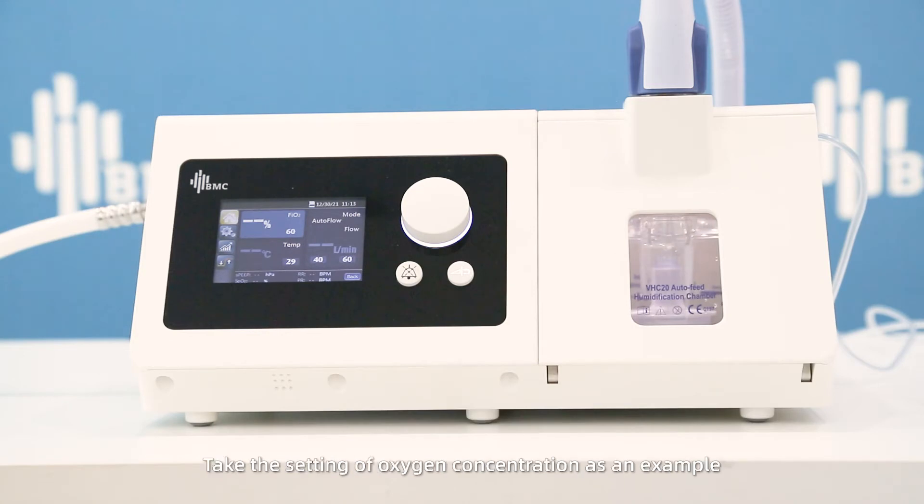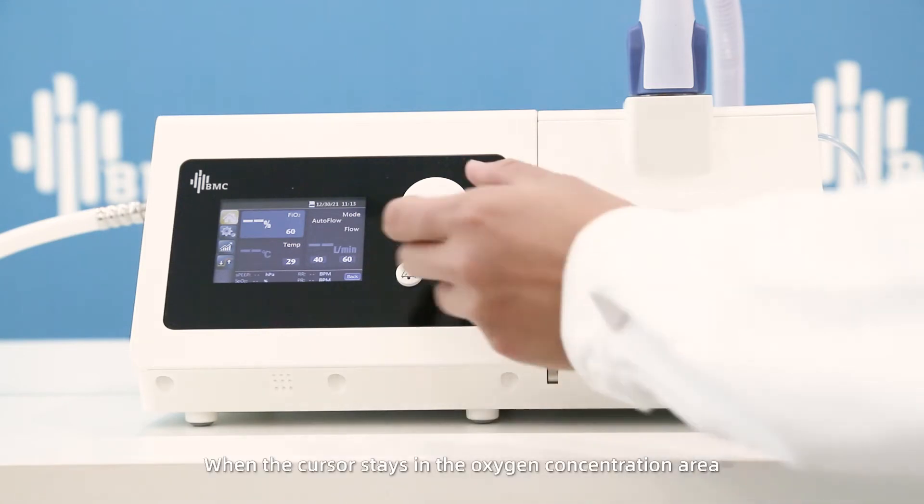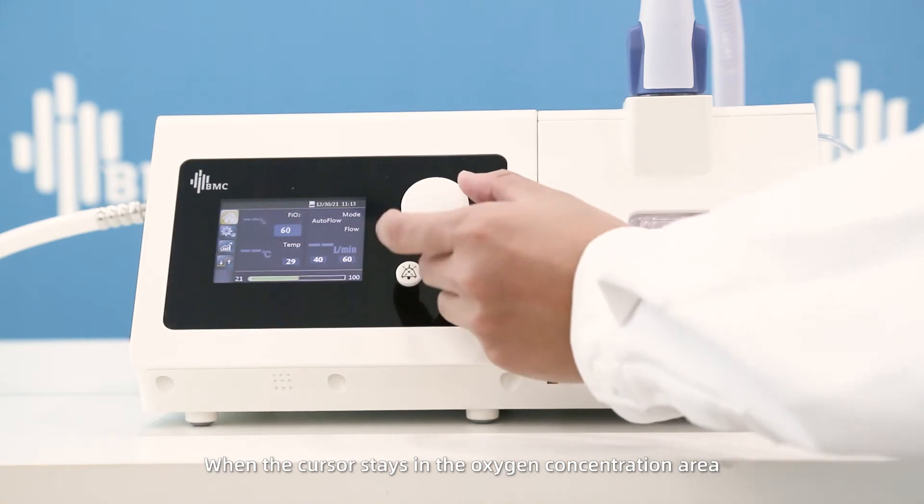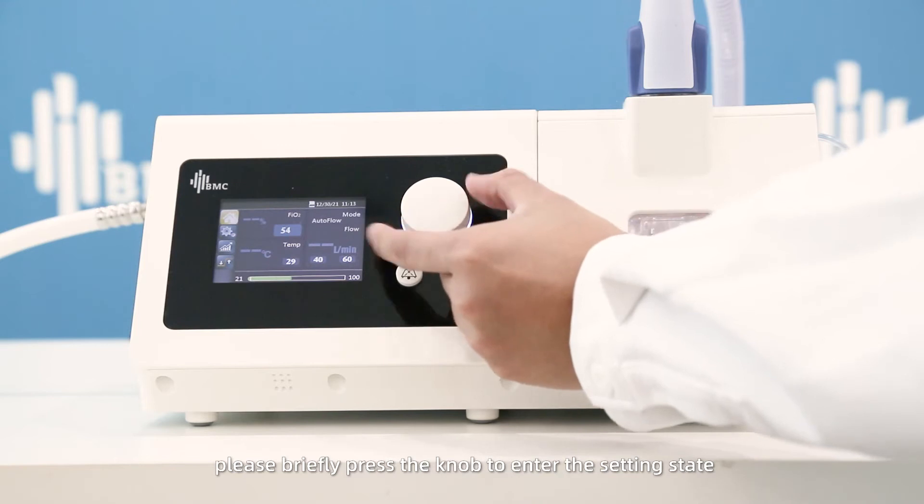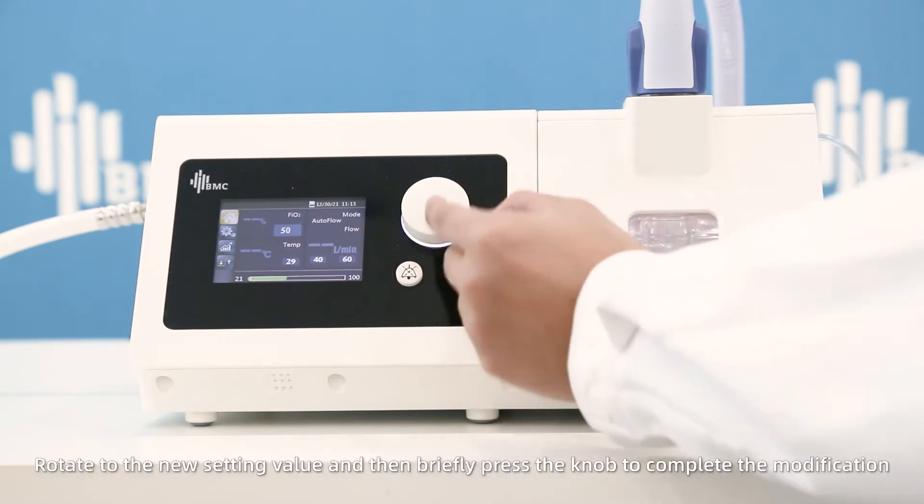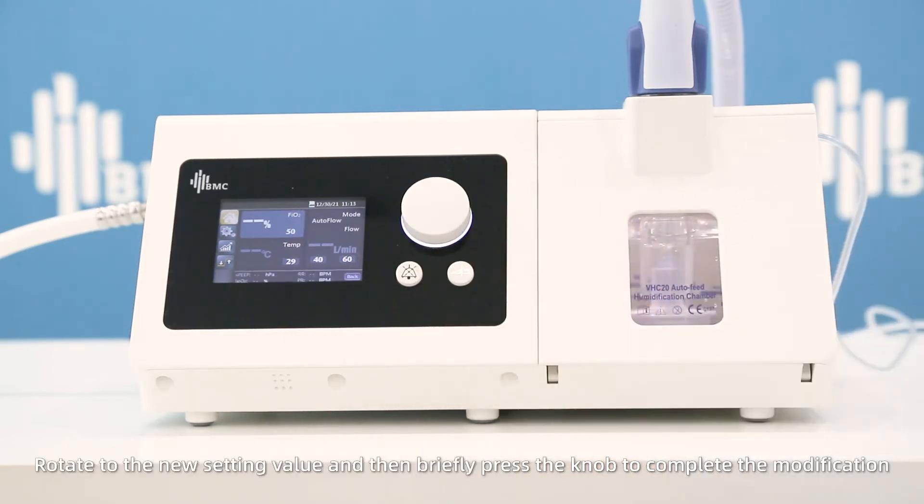Take the setting of oxygen concentration as an example. When the cursor stays in the oxygen concentration area, briefly press the knob to enter the setting state. Rotate to the new setting value and then briefly press the knob to complete the modification.